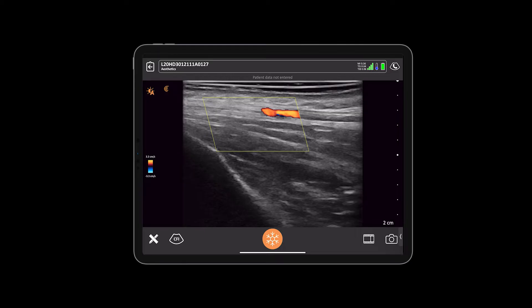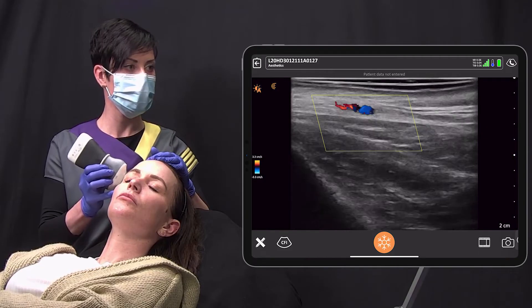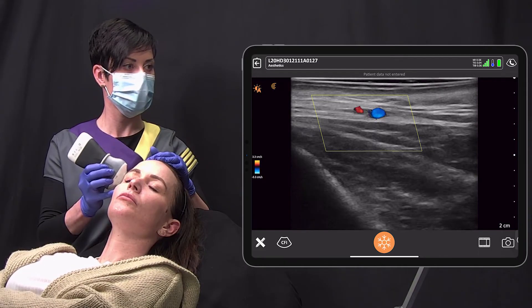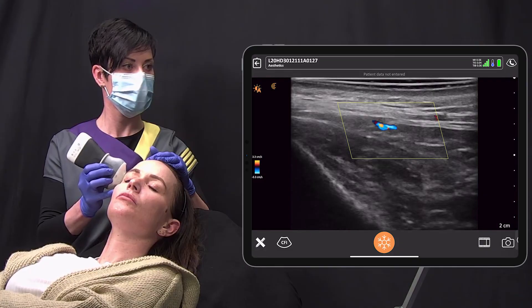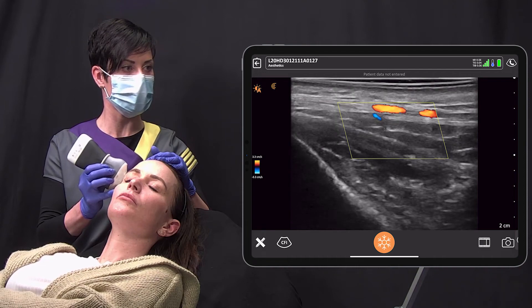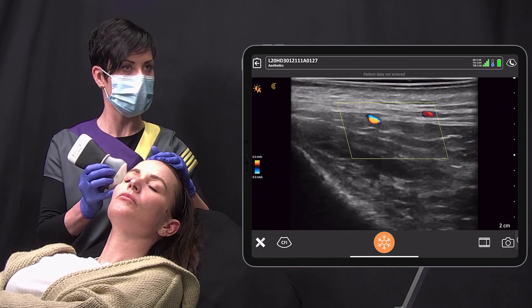What we've got to understand is that even with the one-up-one-over technique, where we touch the needle onto the bone, the temporalis is adherent to the periosteum. And over time, with the action of chewing and the muscle, the filler gets bashed about and squashed around in the muscle, ending up very much intramuscularly — which makes me wonder whether this is such a good idea at all. Here's the sentinel vein, or the medial zygomatico-temporal vein, which gathers blood from the lateral orbital rim and drains into the internal jugular. It pierces the superficial temporal fascia and the superficial layer of the deep temporal fascia, and here you can see it snaking through the layers.